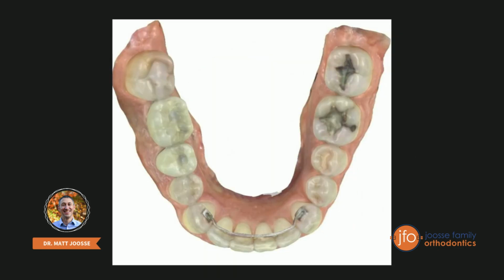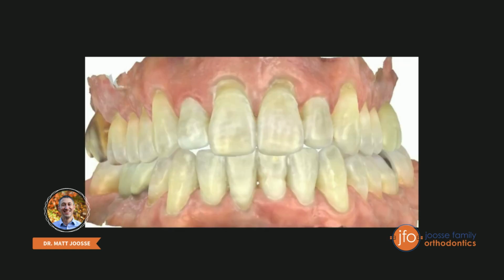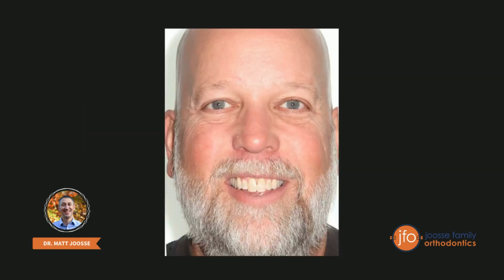These are the lower front teeth. Again, in order to help preserve some of the resolution of the crowding that we got, I placed this lower bonded retainer behind the lower six front teeth. And here's a look at Paul from that start. Note that we have less gum recession on this lower tooth because it's been brought back into the arch and it's no longer hitting in a traumatic way these upper front teeth. So some pretty amazing changes. This, of course, is my favorite change. Just wow, what a nice smile, and to see Paul confidently displaying that smile really just warms my heart.